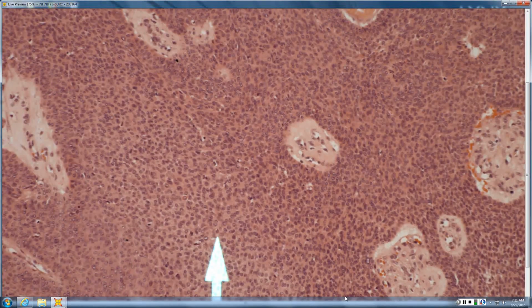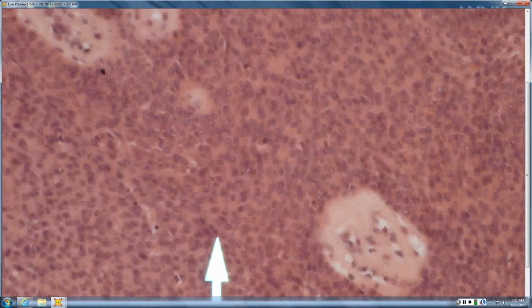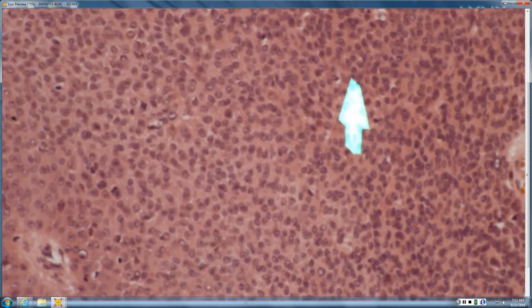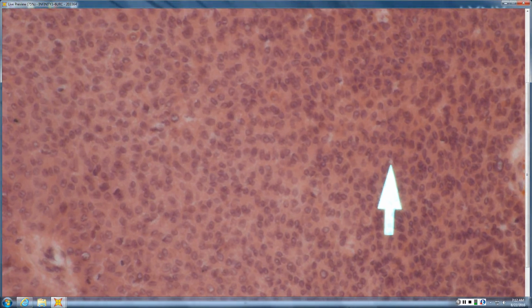And it can be difficult sometimes. That's where you rely on staining and whatnot. But these are pretty good for those poroid cells. The other thing that can be helpful is actually seeing true ducts, whether it's little intraluminal ducts, and you can kind of see them here. They're pretty small, but that's what helps you in the clonal intraepidermal proliferation differential. When you see these itty-bitty small ducts, that helps you say, oh, it's hidroacanthoma simplex and not clonal SK or clonal Bowen's or something like that. So enough on that. It's frustrating, I know.